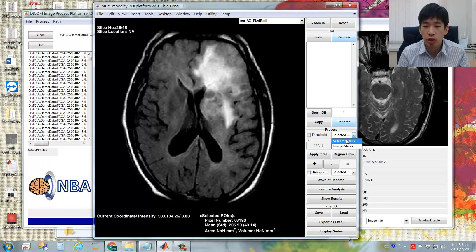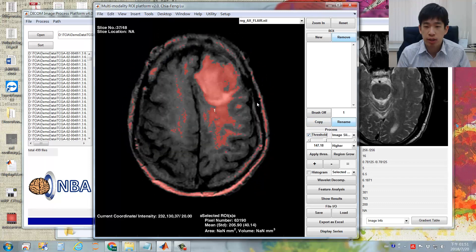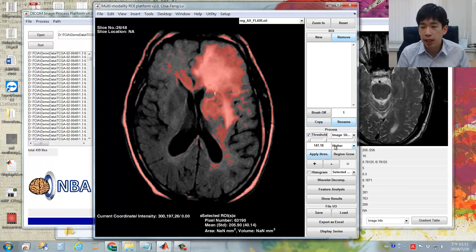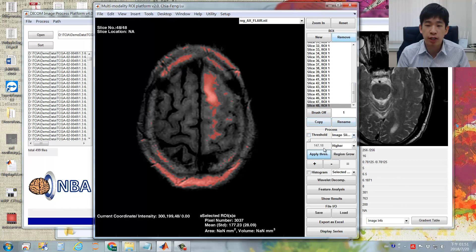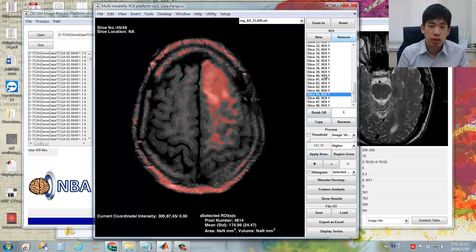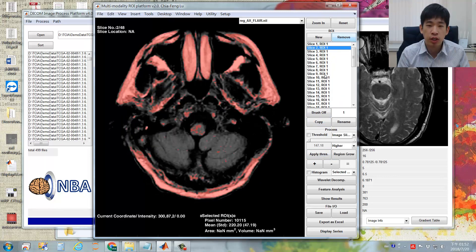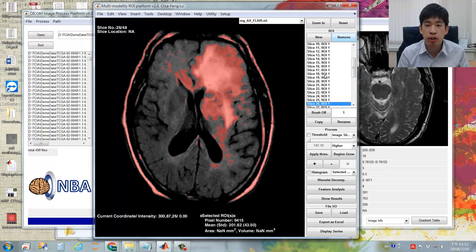Switch the threshold mode to Image Slices and click the threshold. Unlike the previous process, now the threshold applies to all slices — pixels higher than the specified value will be preserved; otherwise they will be removed from the ROIs. Click the Apply Thresholding button, and the program will create ROIs for all slices with the specified thresholding condition. As you can see, not only the target region but also many regions outside the brain were included in these ROIs.